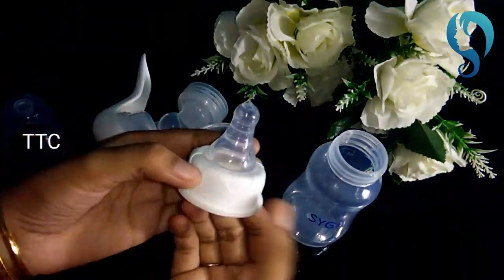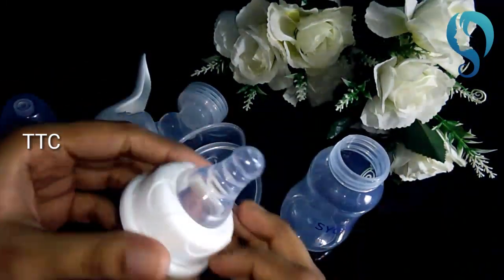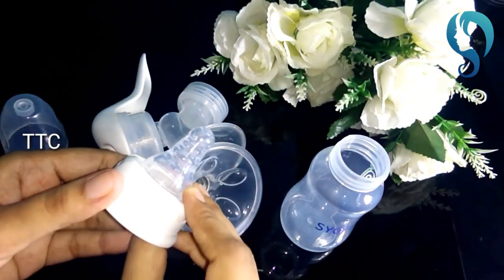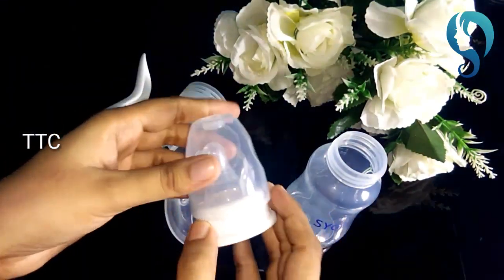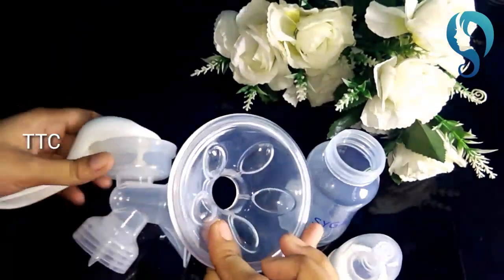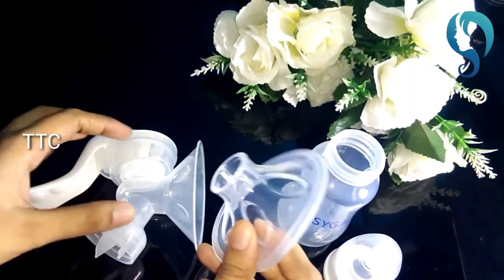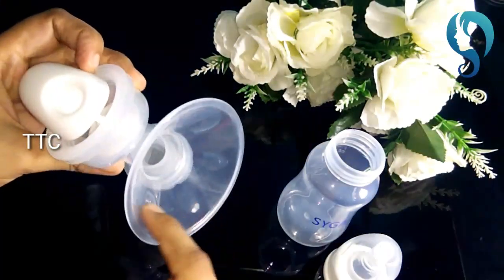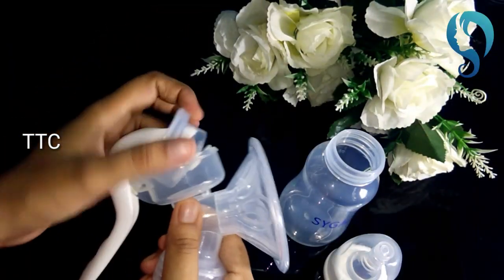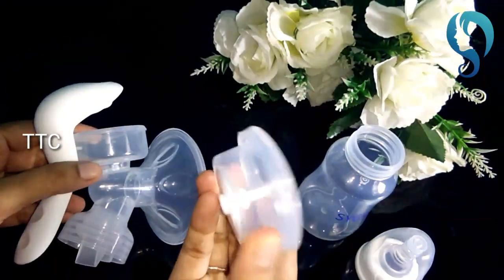It is very strong. The nipple is very soft — the baby will suck it very comfortably. You can also find an outer cap, a 3D massage cushion, and a pump. The pump has a pressure adjustment feature.